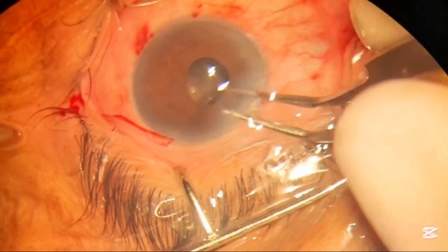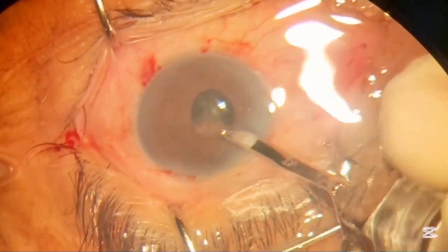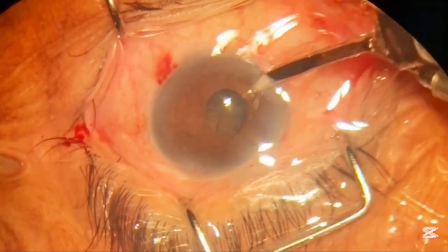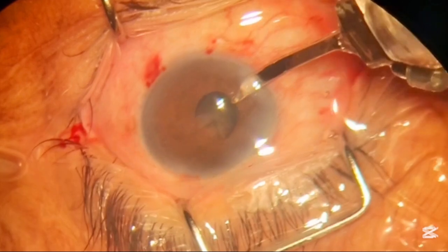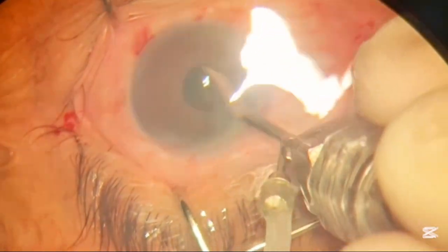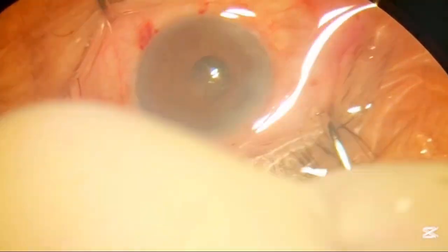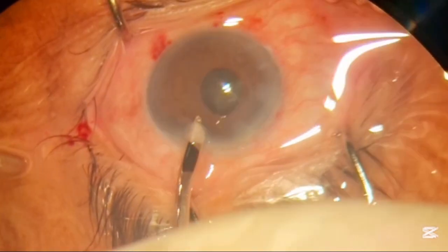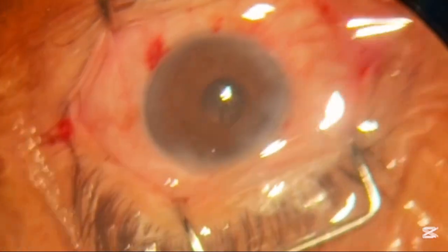I'm showing the McPherson now — we are crushing this part using a holding and pulling out maneuver so we can remove it safely. We are removing the lens matter from the bag, which is difficult as the pupil is small. This patient has multiple issues related to intraocular pressure and is being managed with different medications including acetazolamide, topical drops, and other methods.